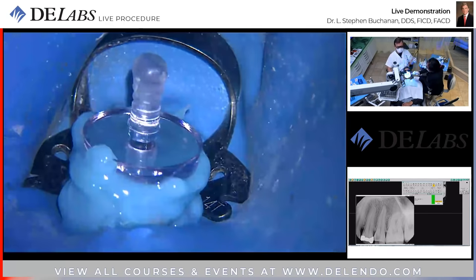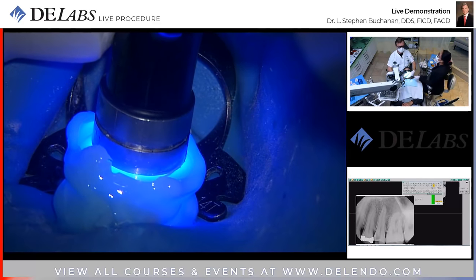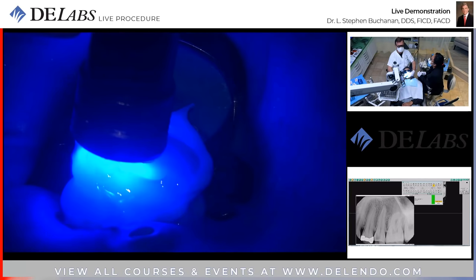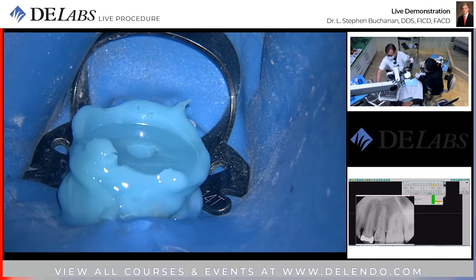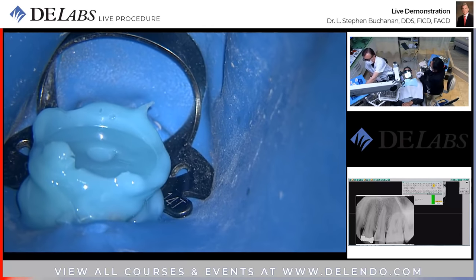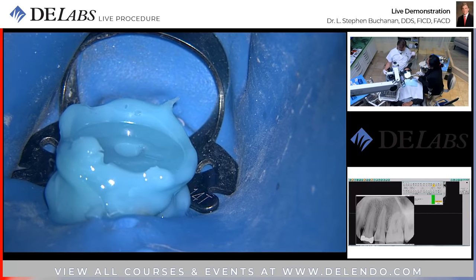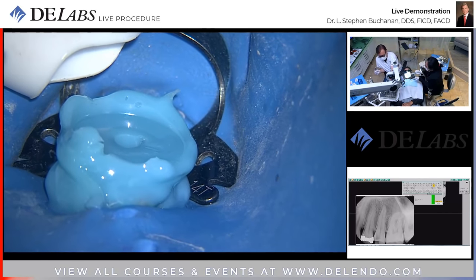Take that for me. Okay, so instead of that taking several minutes, we're done in less than a minute. I'm going to go back to the LA diamond burr, slow RPM. I usually like to have a little water spray because it gets all the junk out. Let's see what we have up in there.